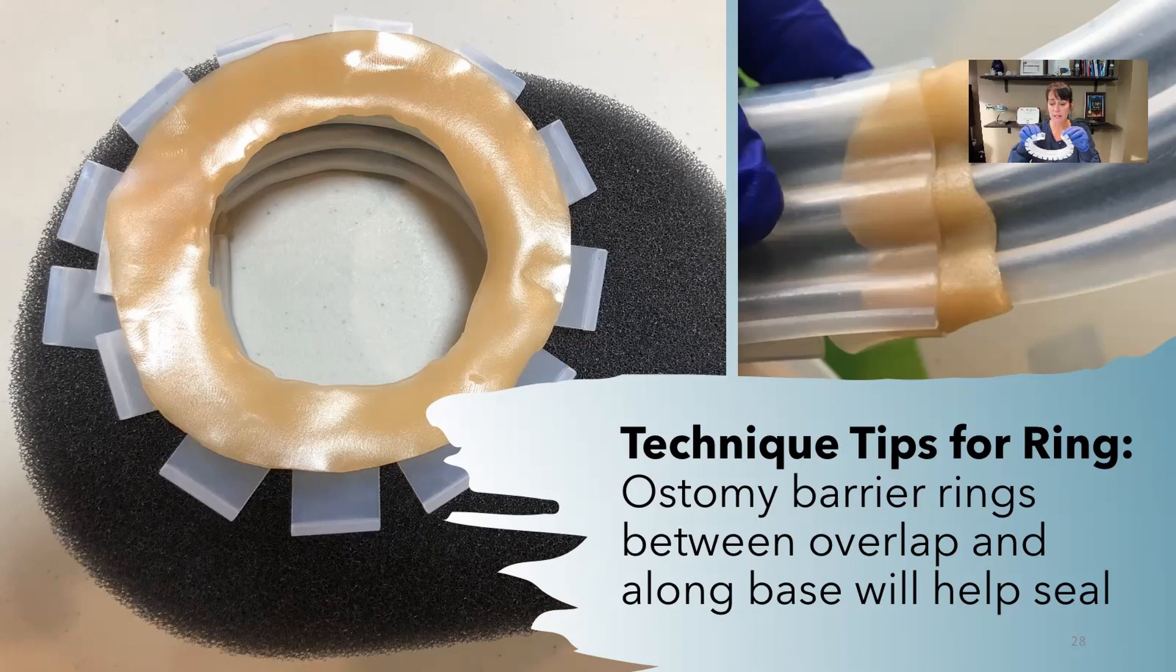Even if you put it over itself, I think you'd still would have a bit of an air leak. So you have to use that barrier ring kind of squish it in there, so it makes a nice ring.